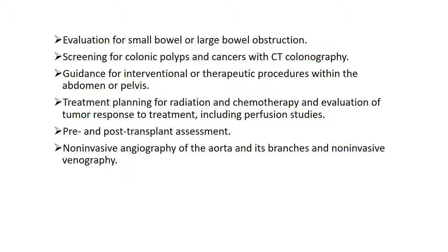Screening for colonic polyps and cancers with CT colonography, and this was something that came out a few years ago as the next big thing, a CT virtual colonoscopy. The problem with that is that you don't really truly see what's going on inside the bowel. It does give you 3D imaging. That's helpful, but it also has some limitations, including the fact that it can't differentiate between a colonic polyp or stool that's remaining within the bowel.